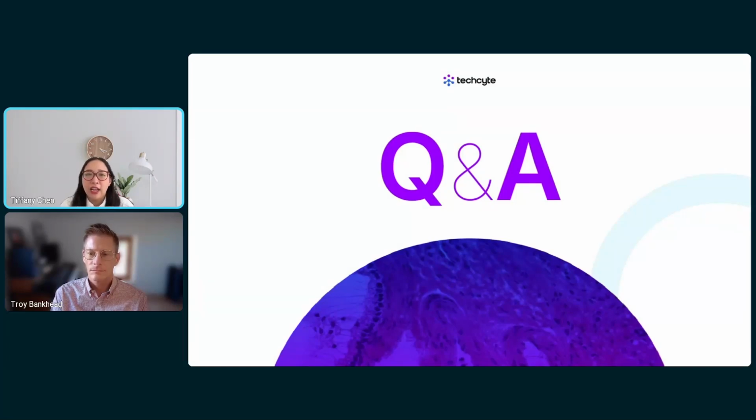And I also think that for pathologists that don't do a lot of frozen sections, they might not want to commute to the lab every day. I think a lot of pathologists live further away from the institution. So for the off case that they're covering frozens, this can really help them not have to physically be there by enabling remote review. So I think there's still a lot of value to low volume hospitals and labs as well.